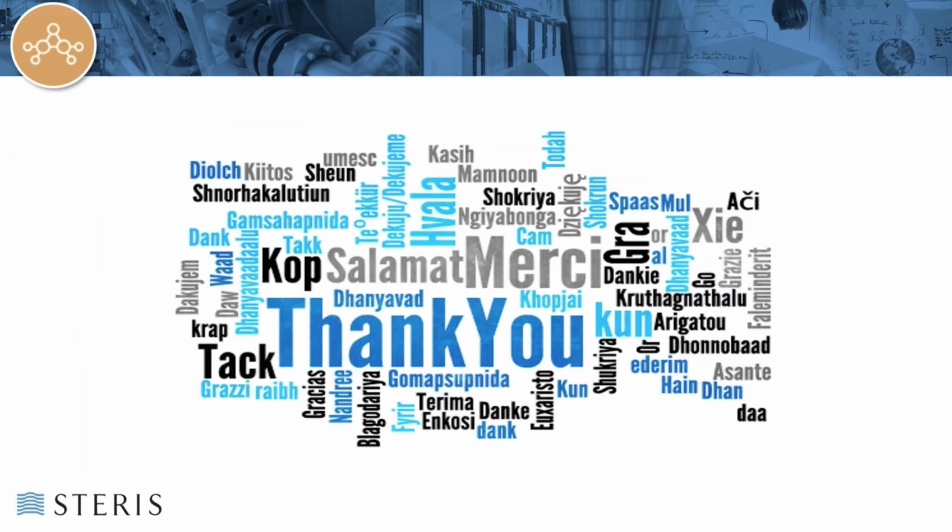The ISO Technical Committee TC 194, Working Group 11, has approved work on the revision of ISO 10993-7 with a targeted publication date of November 2025. Some of the items currently under consideration are reducing the body mass from 70 kilograms to 50 kilogram adult in accordance with ISO 10993-17.